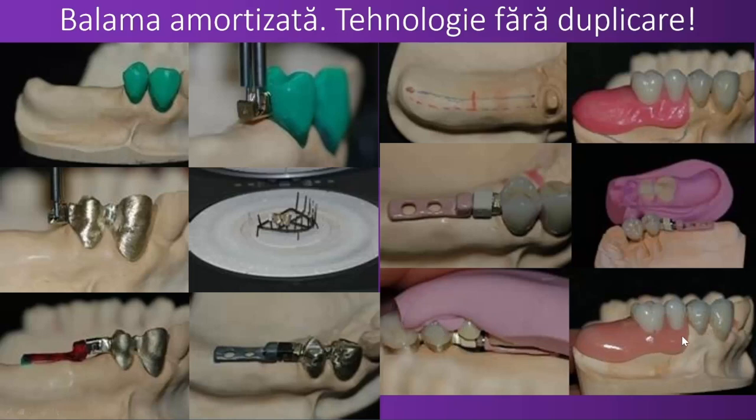You don't have to invest it, you don't have to duplicate it. It's quite simple to use. It seems simple, looks simple. Well, it's not that easy, but anyhow, it's way easier than classical dentures that need duplication. So our patient has a solution for a uni-terminal edentation, Kennedy class 2. There are other companies that have imagined attachments for such cases. This is not the only solution for uni-terminal cases, right?